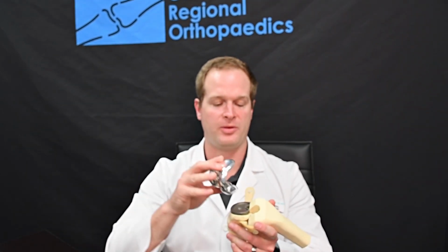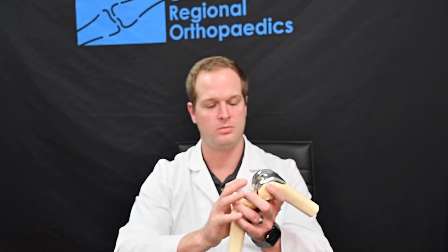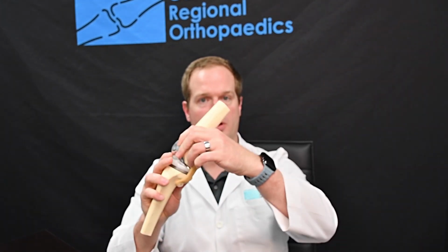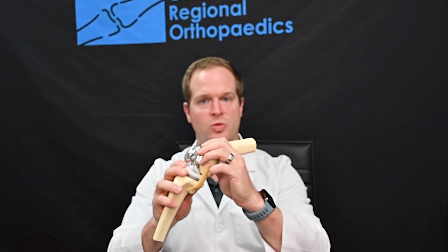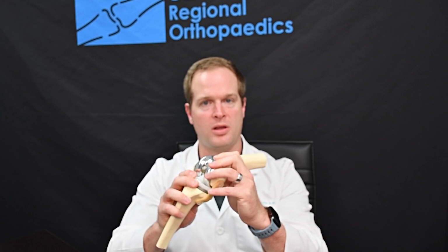I then take a piece of cobalt chrome. It caps the end of the femur, like so. This is the real piece here. A piece of plastic goes in between the two, and the knee joint goes back on top of itself. It will then rock back and forth. The plastic acts as the new slippery and smooth cartilage to help alleviate some of your stiffness, pain, and swelling.